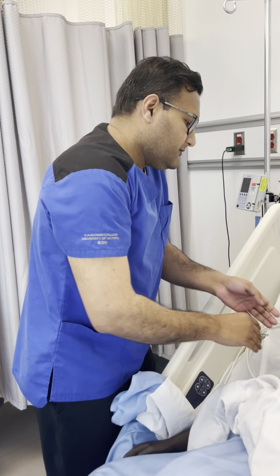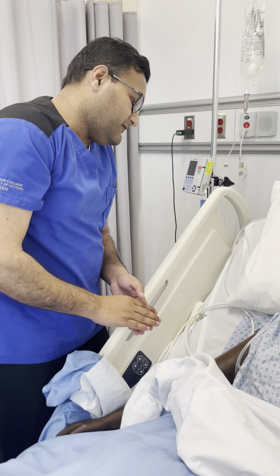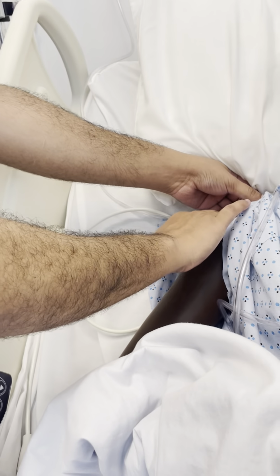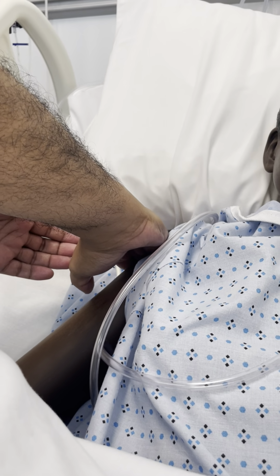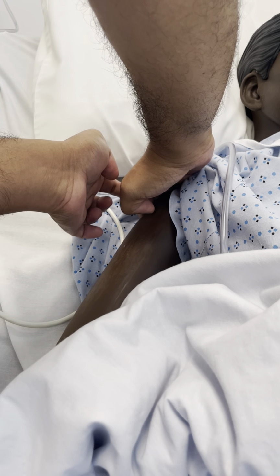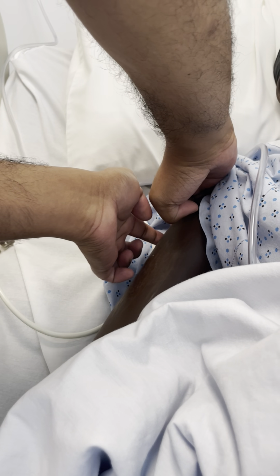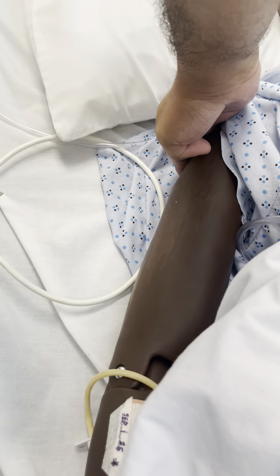Excellent. Now, this medication will be applied onto the deltoid muscle. I will first do a landmark for the site. And to find the site, I have identified the acromion process, which is this bony region up here. To identify my landmark, I'm going to use the four-finger technique, using one of my fingers covering the acromion process, and the landmark region will be underneath the fourth finger, which is just three fingers below the acromion process. It will be an upside down triangle shape. And so this would be a region that I would use for my landmark. Perfect.